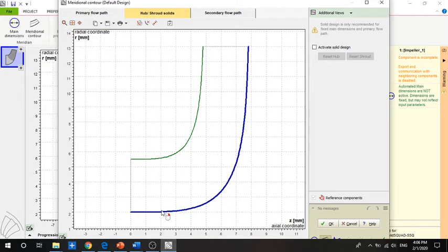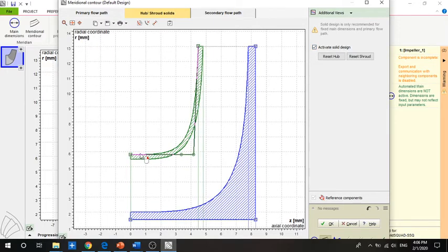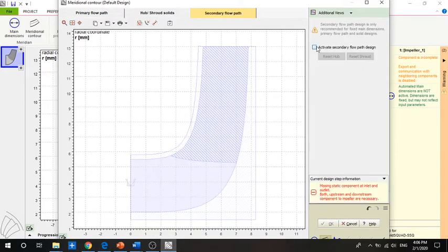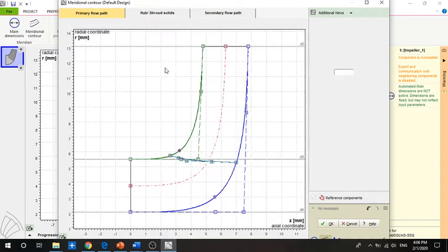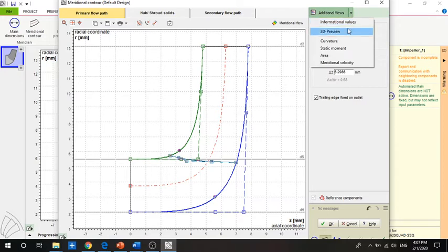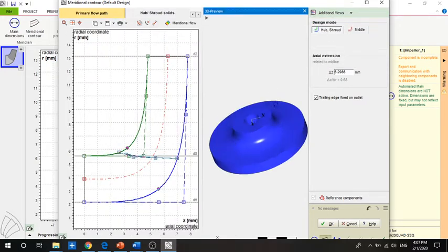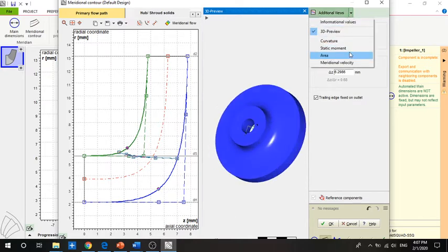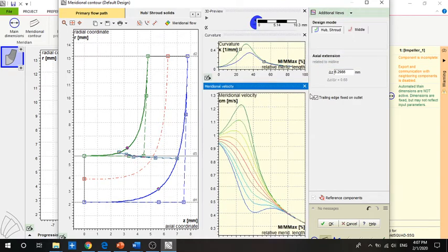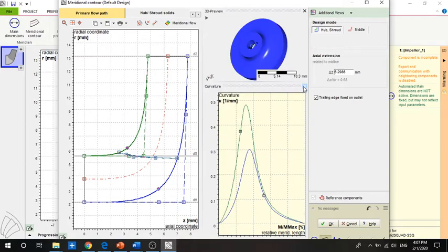There is another option where you can add thickness to the impeller — activating this lets you enter the blade thickness. Activating flow path enables the path which flow is escaping from the impeller, but for an initial study we won't activate this part — we'll use a simple impeller. There are also previews and useful data about velocity triangles projected by CF-Turbo.